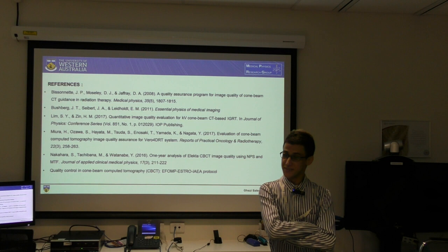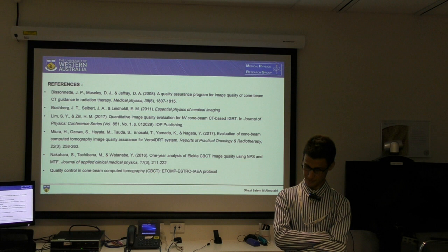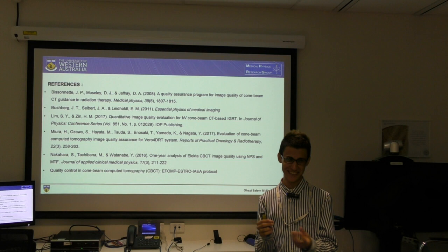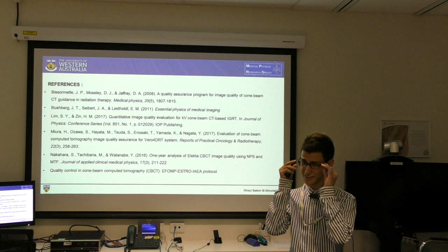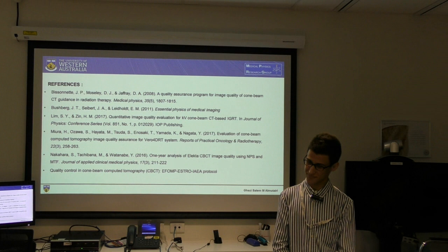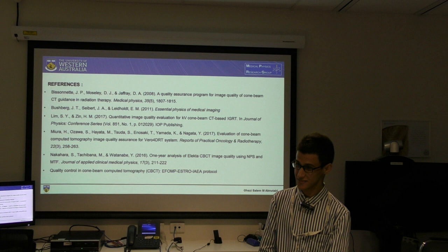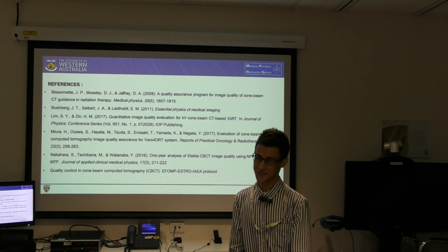When you are measuring the homogeneity, how do you know the phantom is homogeneous? For the Catphan there is an insert. There is an insert in it just to calculate the homogeneity. So it's meant to be manufactured that way? Yeah, I think so. Is there a way you might be able to verify that it's homogeneous? I have to look into it.